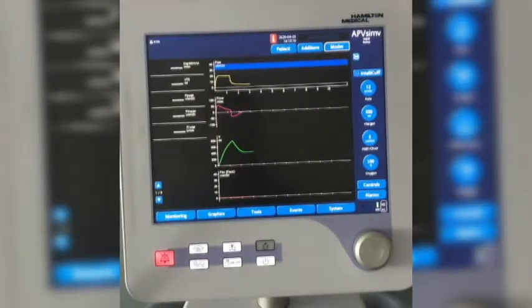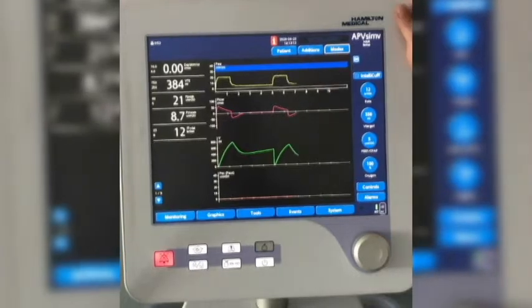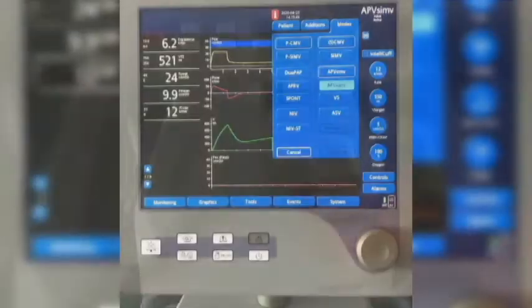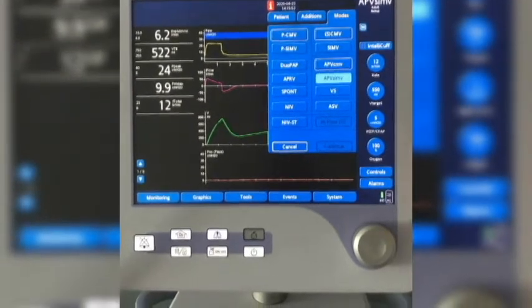The respiratory therapist enters data, known as ventilator settings, into the ventilator. The ventilator will then interpret that data and output breaths to the patient by the breath delivery unit through that circuit tubing and into the person's lungs. These breaths may be supported or completely controlled if the patient is not breathing at all.